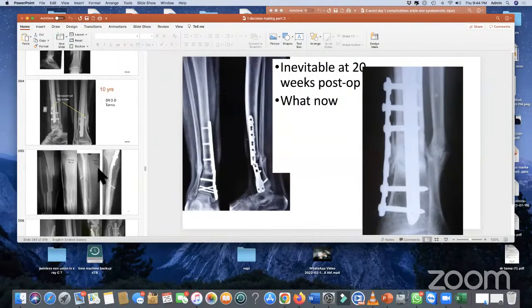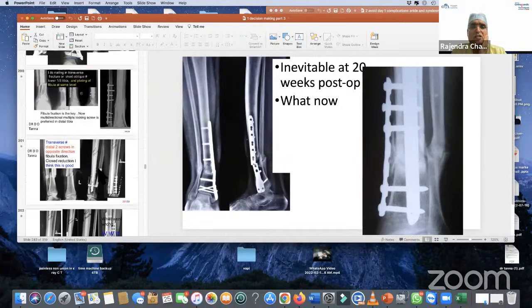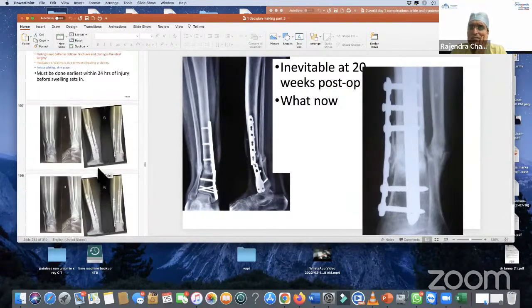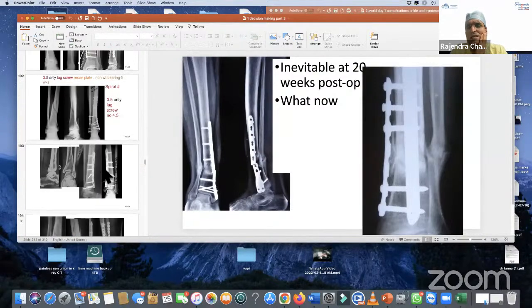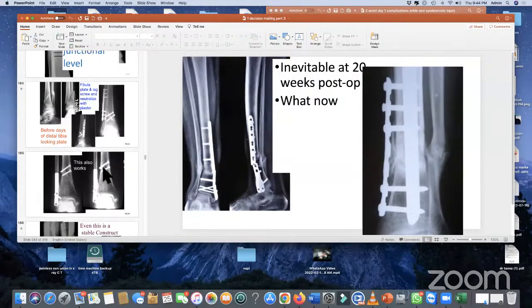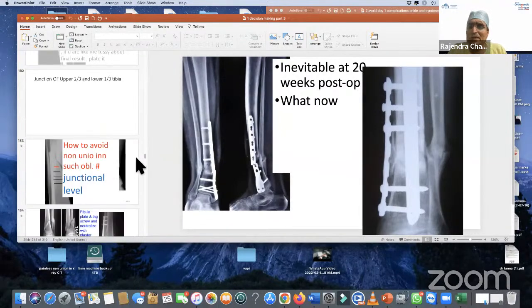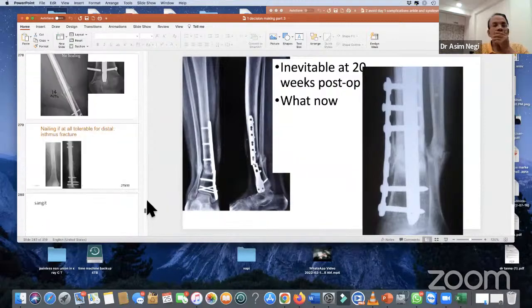In this particular patient, it was not a parchment skin. And also initially this patient was in valgus. So when we corrected the valgus, we had added skin available. So in this patient, the skin healing was absolutely fantastic, and the skin closure was also very good. Sometimes it is a concern. Yes, sometimes it is a concern. In those situations, I think we have the expert tibia nail where we don't have to put anything subcutaneously. So no problem.